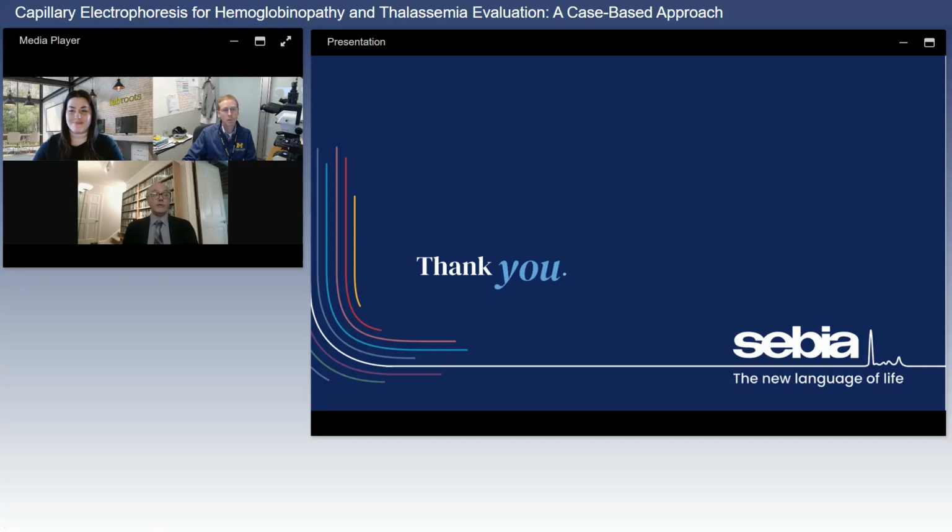And we try to give a nice, comprehensive, but not overly assured interpretation of what the pattern is consistent with, and offer you some ideas of what you may be looking at. Of course, for extremely esoteric things you would probably have to reflex up to genetic analysis if it's clinically indicated, if it's considered significant enough to have a strong clinical impact. But those are some of the resources that we do offer for help in interpreting the capillary electrophoresis.